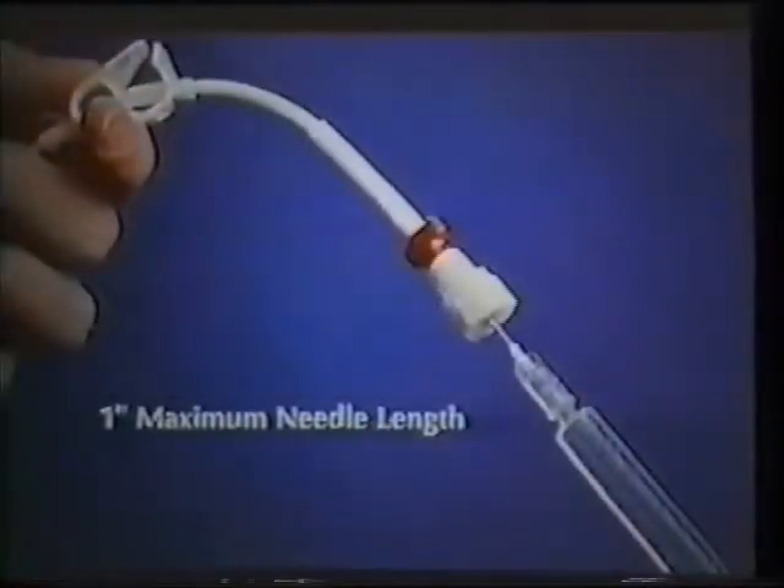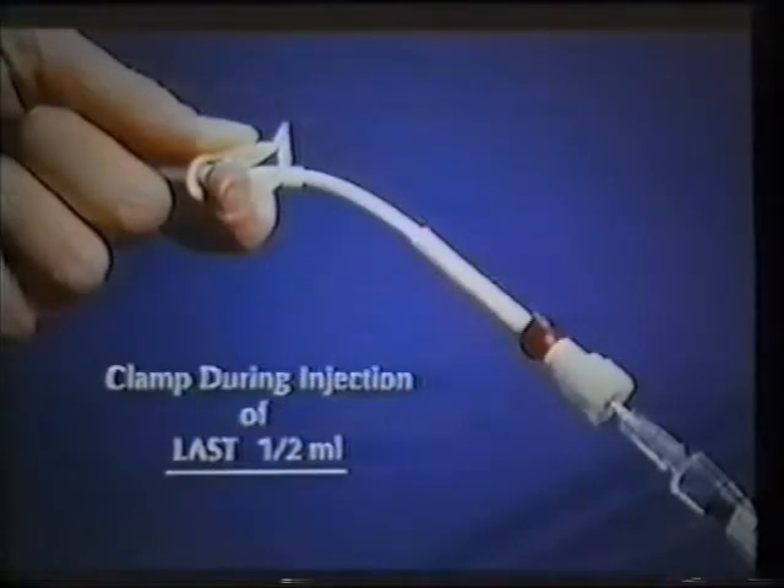Insert the needle through the injection cap. To avoid puncturing the catheter, do not use needles longer than 1 inch in length. Release the catheter clamp and begin injecting the sterile heparinized saline. As you inject the last half milliliter of solution, clamp the line. This clamp must remain in place as long as the line is not being used and must be clamped as you inject the last half milliliter. When you clamp the line like this, you prevent the backflow of blood at the catheter tip and help to prevent clotting.